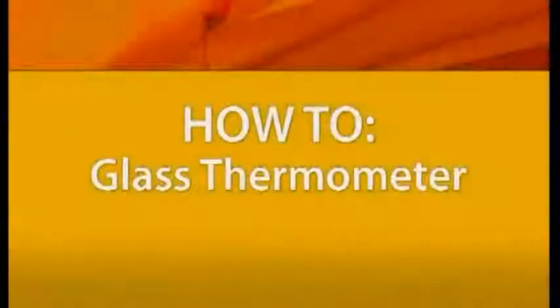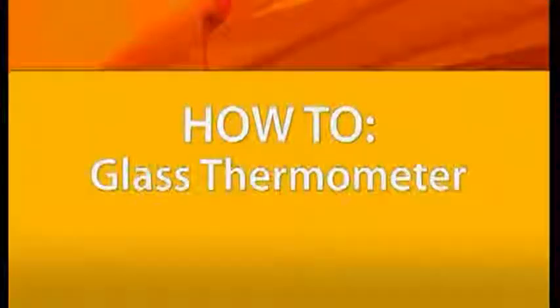We are now going to discuss the use of a glass thermometer. Rarely are these used in communities, but we're going to cover the instructions just in case you would have a need to use one day. Once again, there should not be anything hot or cold in the resident's mouth for 10 minutes before taking the temperature. Take the thermometer out of its holder.